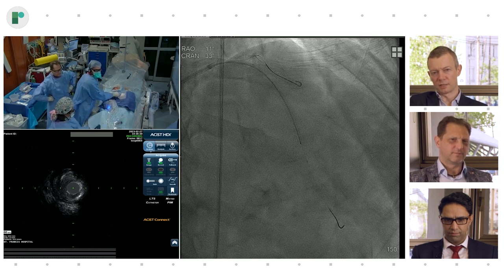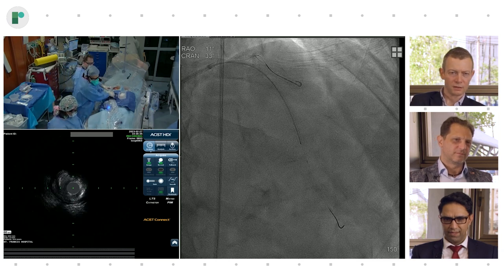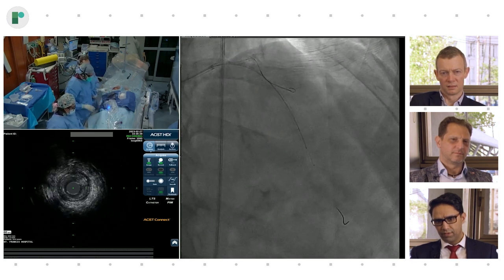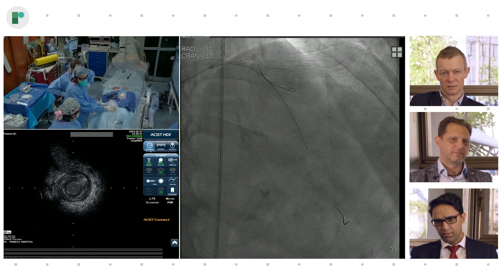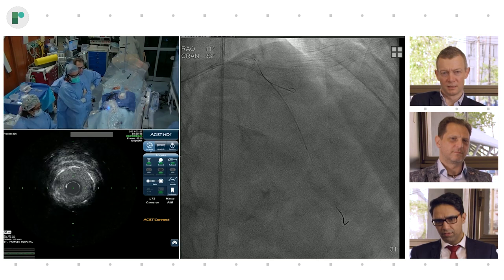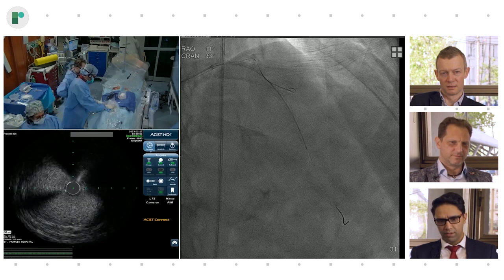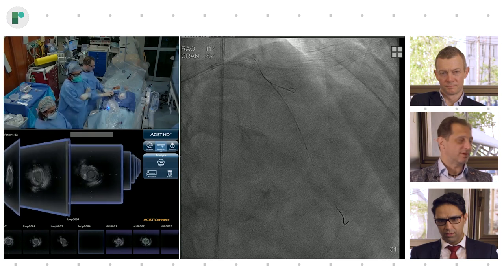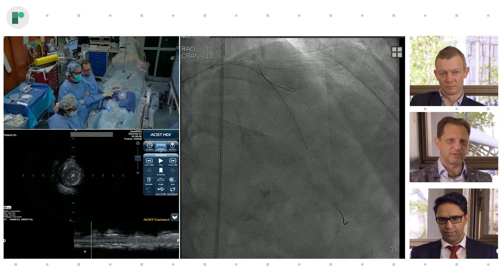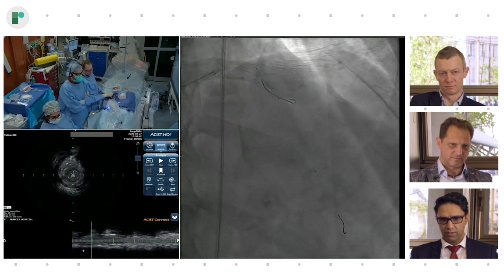Here it looks difficult, right? I mean, you see the catheter, you see there's likely not a lot of flow here. Right, so this could be a problem. See, better. It's all diffuse here. That's distal. So why don't we just do a run from here, right? Maybe that can help. There's something going on. Well, the stent itself approximately looks okay on this rapid pullback. Something's going on at the distal edge. Is a little questionable. Let's see what we did. Go distal. Go to the edge of the run.